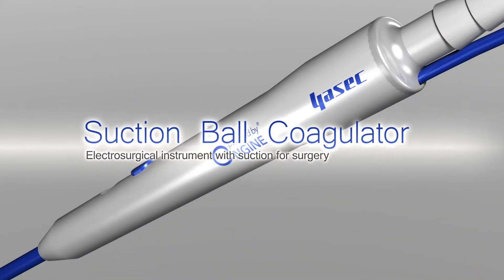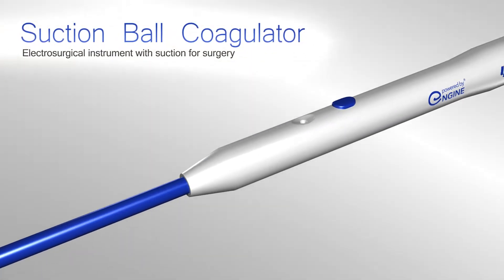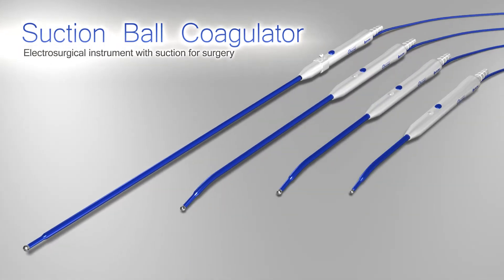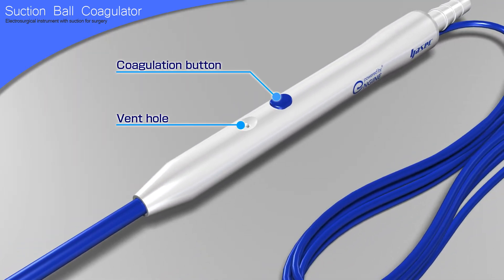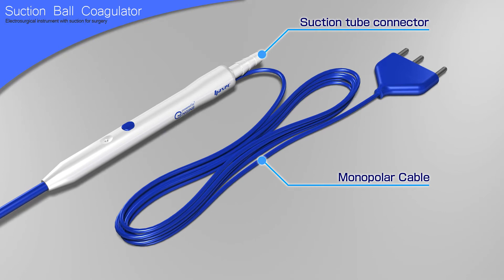The suction ball coagulator is an innovative hemostatic tool that can simultaneously perform suction and electrocoagulation with its ball tip. It has a ball-shaped electrode at the tip, a coagulation button and a vent hole at the handle, and at the back end, a connector for a suction tube and a monopolar cable for connecting to a high-frequency surgical unit.